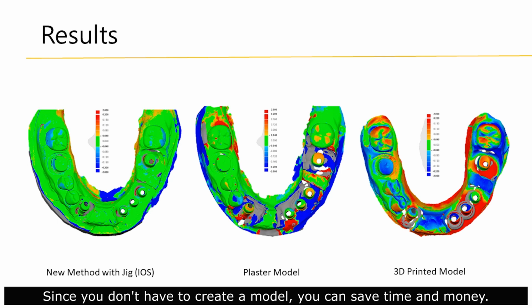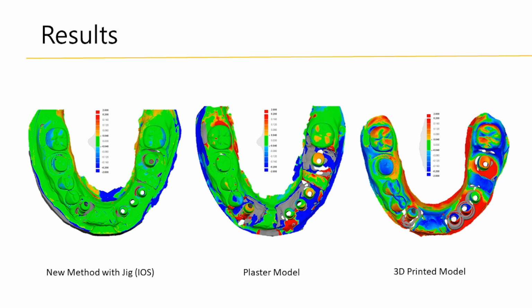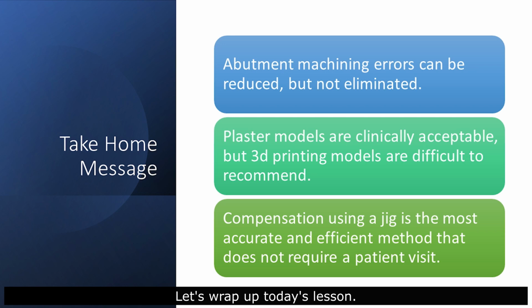Since you don't have to create a model, you can save time and money. Furthermore, by automating this process, it is expected that AI abutment matching shown earlier will be implemented without the patient visiting the clinic. Let's wrap up today's lesson.